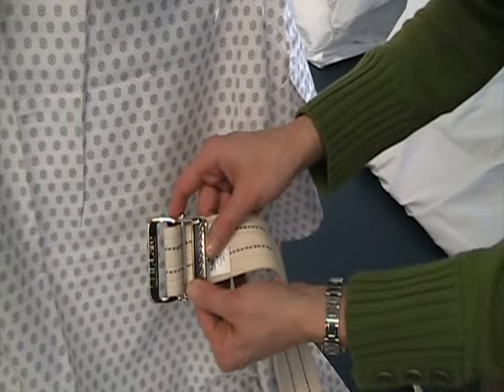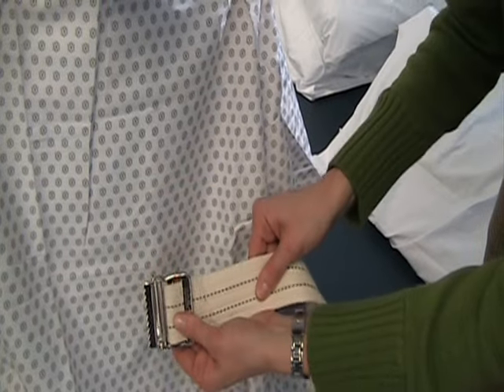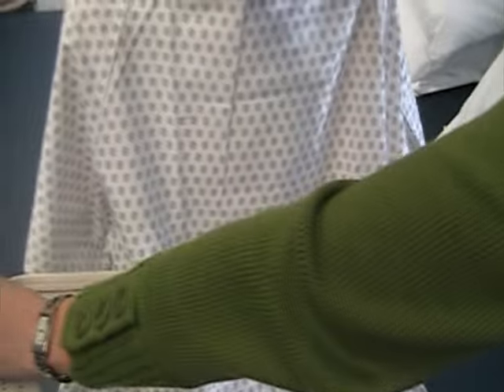This is the correct way to put the gait belt on. The teeth are medial, the belt is lateral, and it can go on this way or this way.